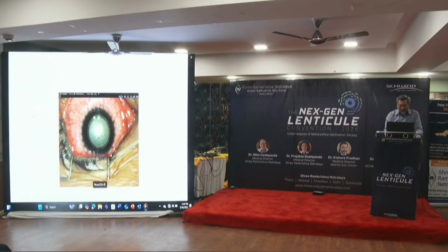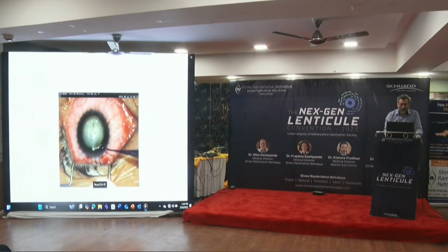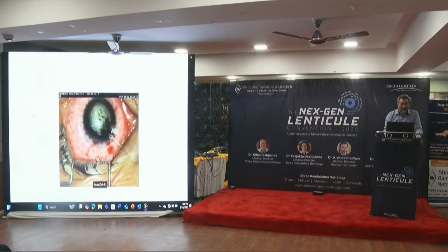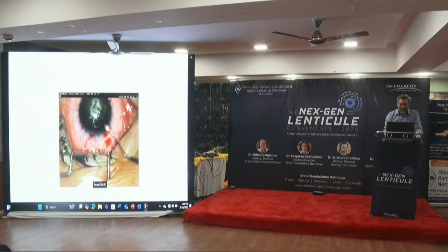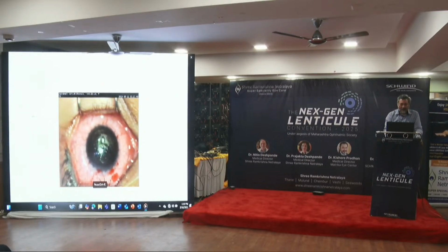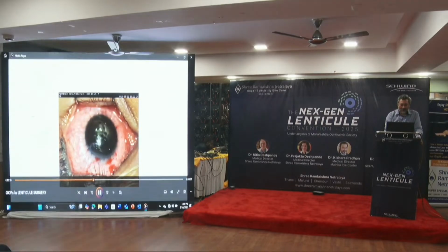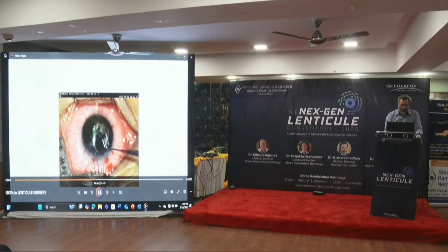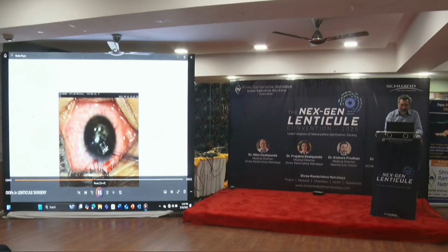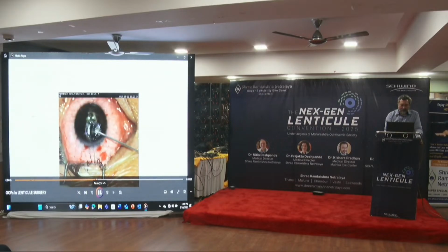So this is a patient, not from Nepal, somewhere else. This has been one of the persons I've been training. If you look at this, I don't know where he learned how to dive into the center so that the patient could see. This is when you land up in the wrong plane. Now the surgeon thought he was on the anterior surface, the anterior cut.